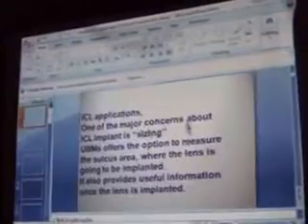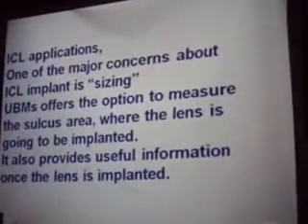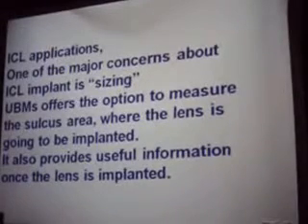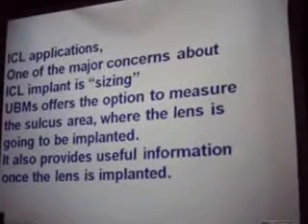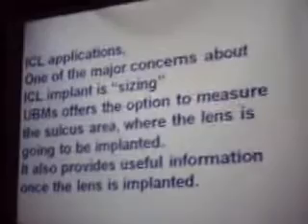The next topic we're going to talk about is phakic refractive IOLs. It's what is known as ICLs mainly. ICLs are manufactured by STAAR, a company in the US, which is growing very fast because it's probably the only solution for the high myopes that cannot go through refractive surgery. That represents a good option for the surgeons, having a patient who needs some kind of correction other than contact lenses or frames.